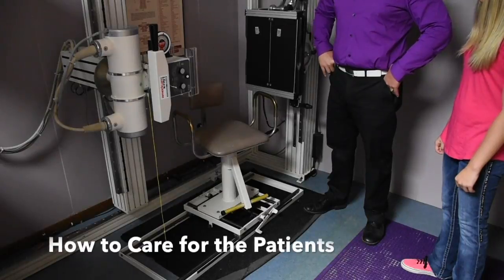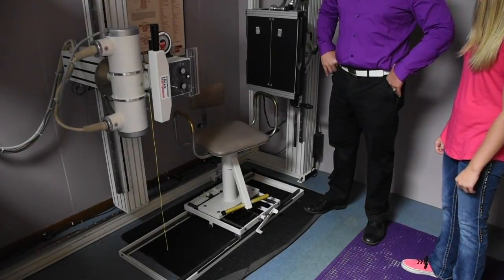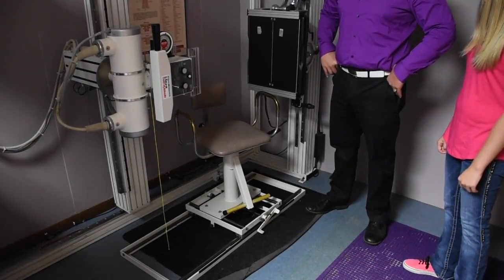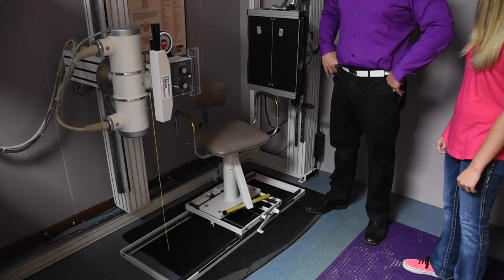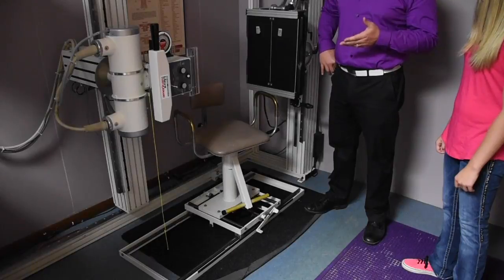When we're instructing the patient to get on the chair, we do want to be very careful. Obviously, this is a chiropractic office. We see athletes, we see children, we see geriatric walkers, canes, wheelchairs, you name it. So we have to use the utmost caution when putting them on the chair.